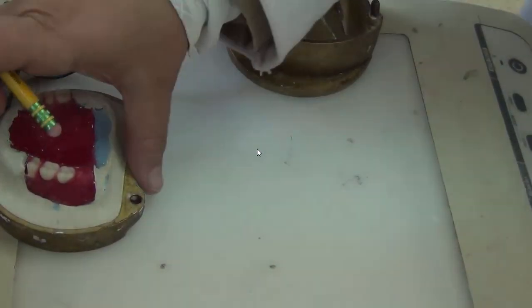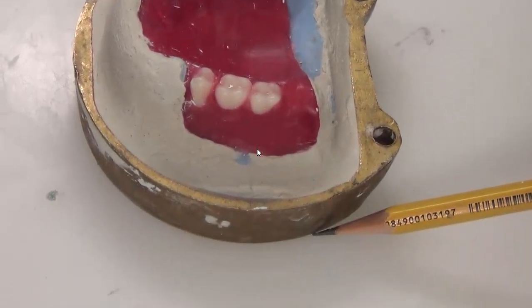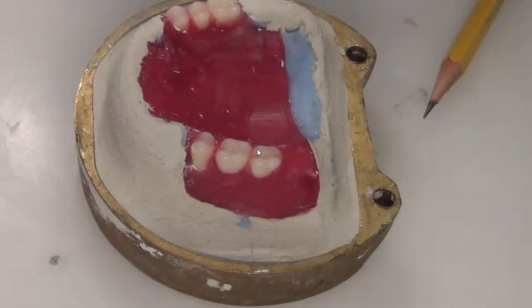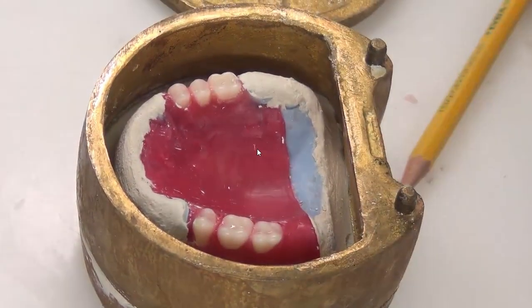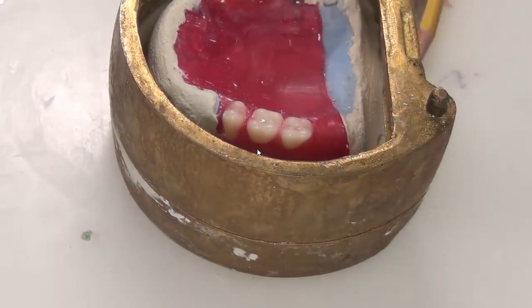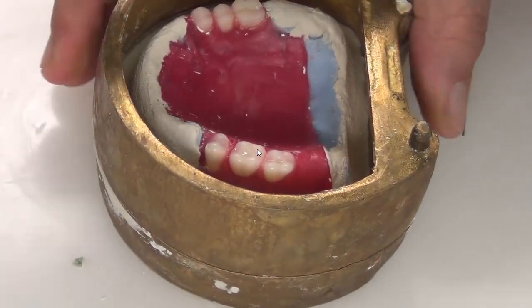So, what's next? What do we have here? Just to revise it, we have the lower member of the flask, we have plaster, we have the cast, and we have the wax-up of the denture. We place our next layer, which is the upper member of the flask. Don't confuse the upper member of the flask with upper and lower flasks. Any flask you work with has two halves, whether we're working with the upper denture or lower denture, okay? So for an upper denture, we use an upper flask. For a lower denture, we use a lower flask. But in each flask, we have an upper member and lower member, okay? Just not to confuse terms. So this is the upper member of the flask there.